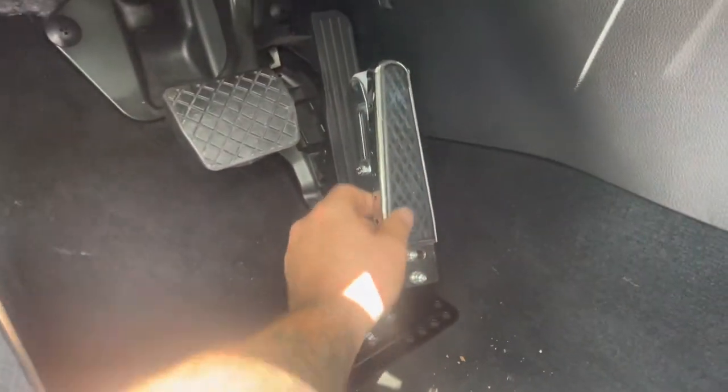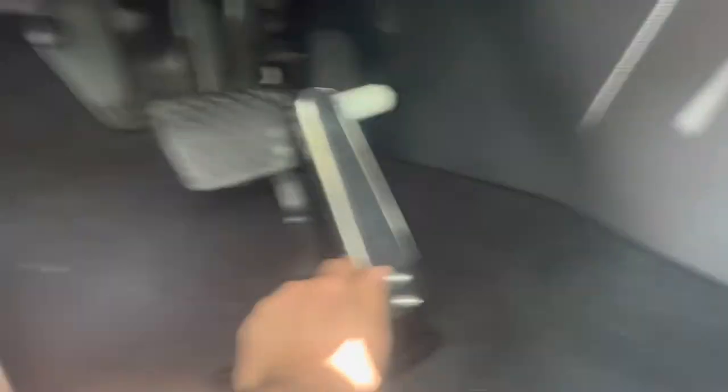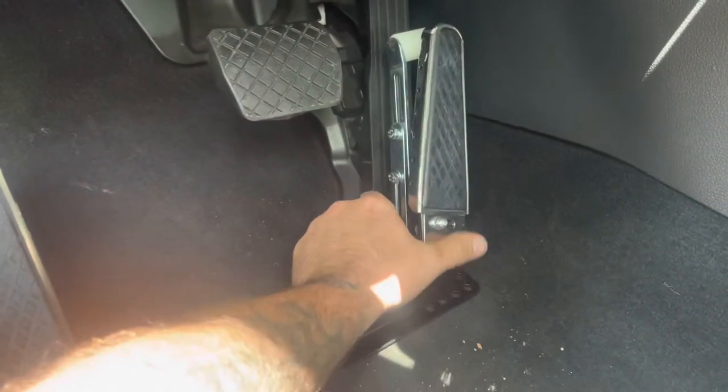We had to adjust — this pedal was hitting like this and it would have interfered with the brake. I think we got it where we want it. Drop the skid guard, and here's something to watch out for: you don't want to drill through those — there's a brake line.